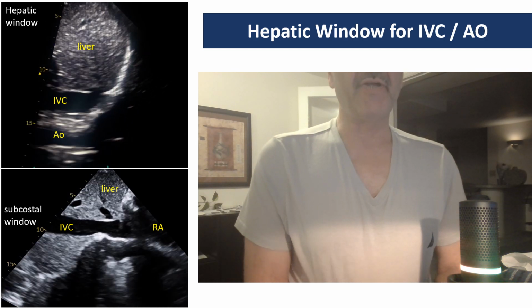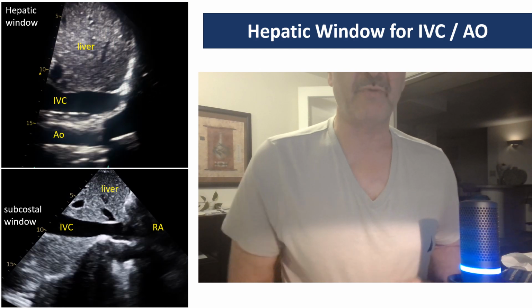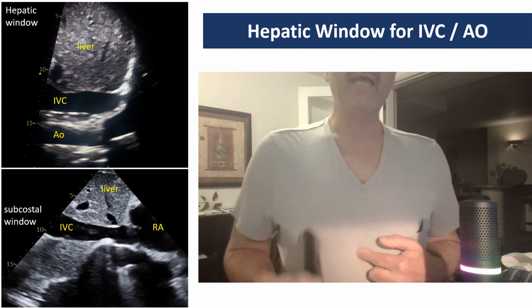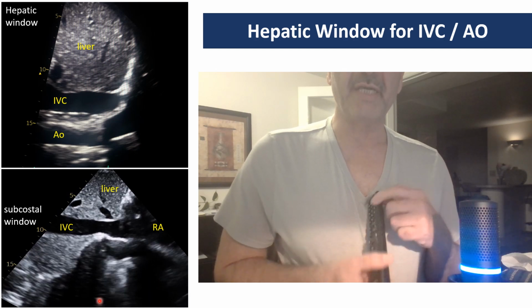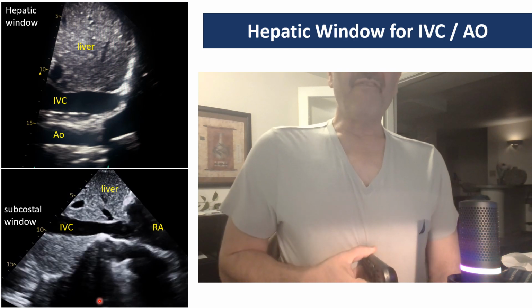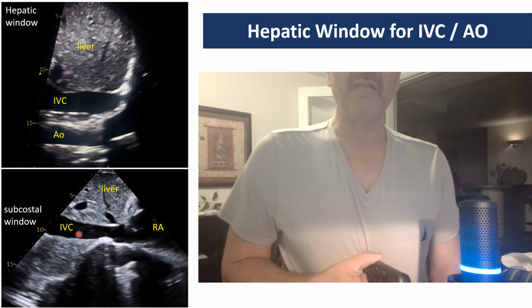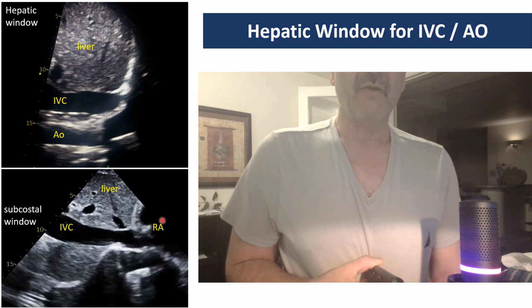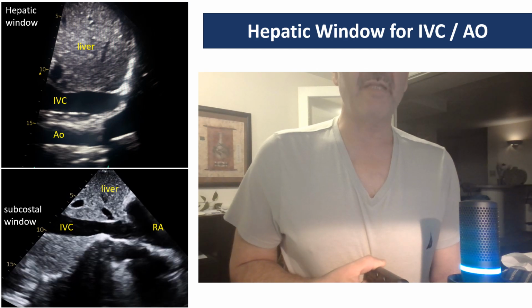Generally, the regular classic approach for IVC and proximal aorta is subcostal. You go below the xiphoid process, and imagine this is the probe, footprint, marker. You hold it at 12 o'clock below the subxiphoid, and firmly press, and as the patient breathes in, meanwhile we fan left and right, we will see one of them, then based on the feature of that one, from that angle the other side, we find the other one.